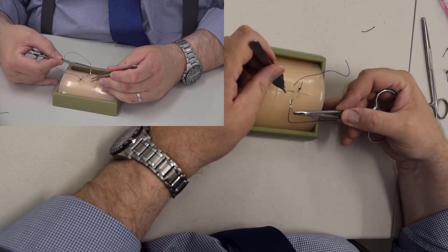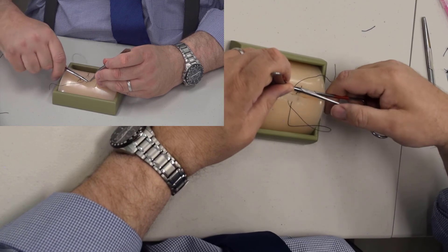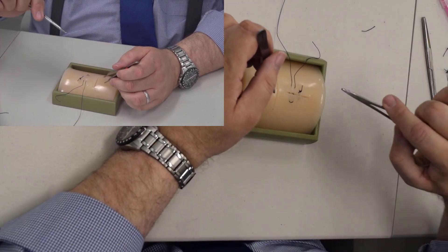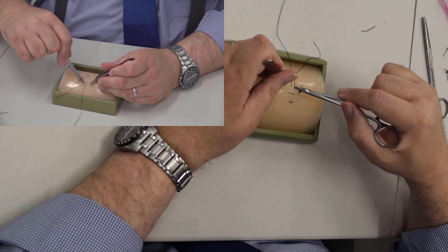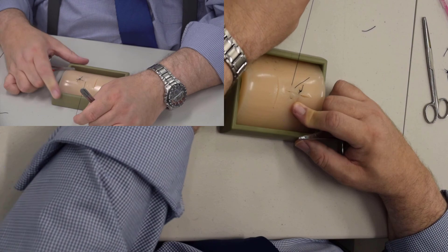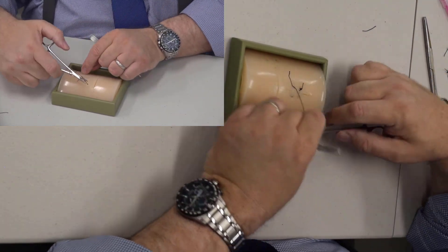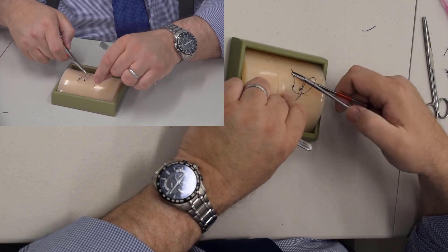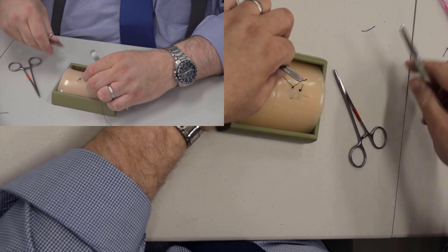Instead of putting our stitch here like with the vertical mattress, we go just about an eighth of an inch down at the same depth, right next to our other stitch. The vertical mattress is a needle going in and coming back out toward the skin. The horizontal mattress just forms the letter U in the skin — I came in here, made the letter U cross, and pulled it back out. Tie it with an instrument tie. You may have to rewind this one several times to see how I did it.